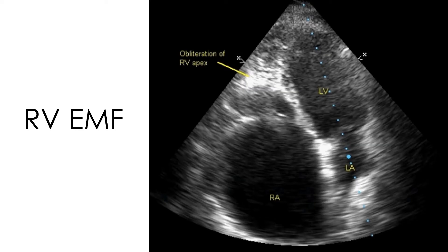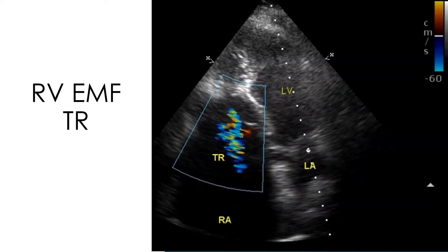Still frame of apical four chamber view in RV EMF showing the obliteration of the RV apex and grossly dilated right atrium. Another still frame in RV EMF showing the tricuspid regurgitation jet by color Doppler imaging.